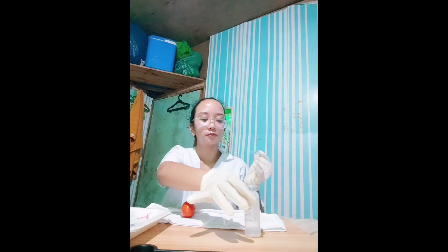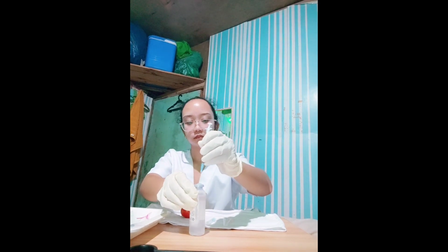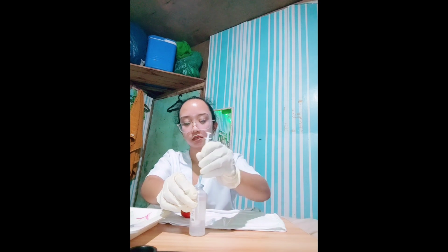I will be performing a subcutaneous injection, into the subcutaneous tissue, at a 45-degree angle. So I will put the sterile water.